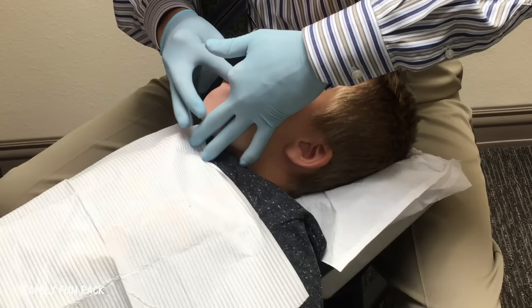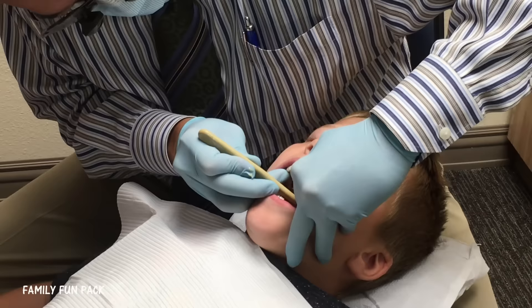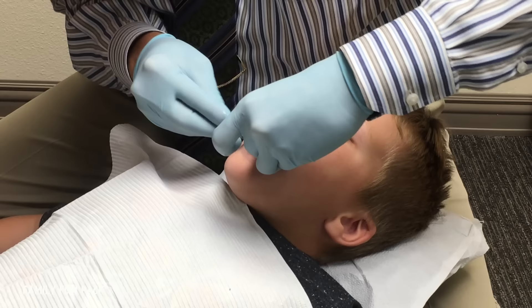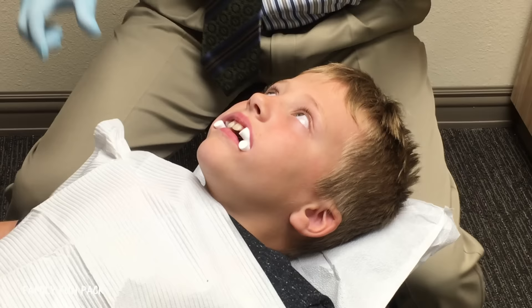We're on the way to the orthodontist and we brought Nanny with us today. We're just going to have the nose gently. Can you see? Let's take it with the nose gently. You did a fantastic job there.